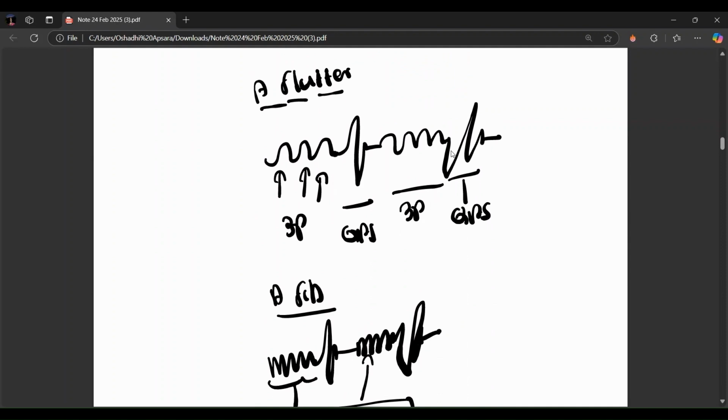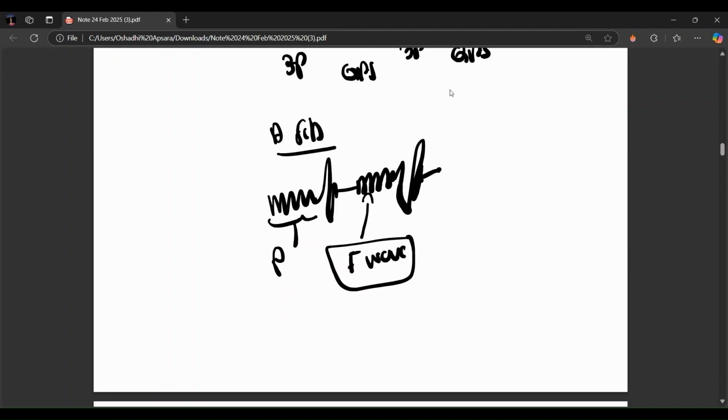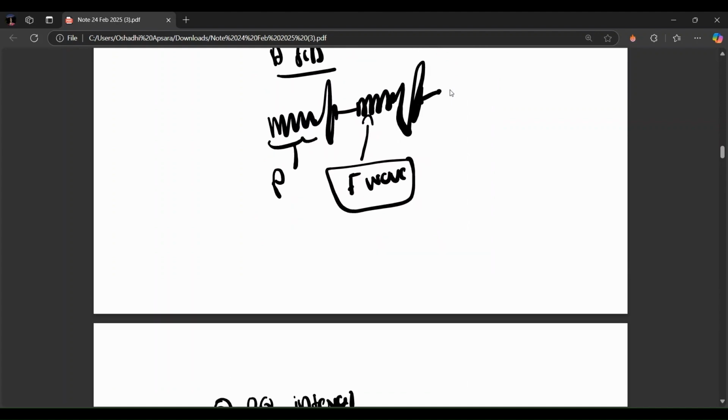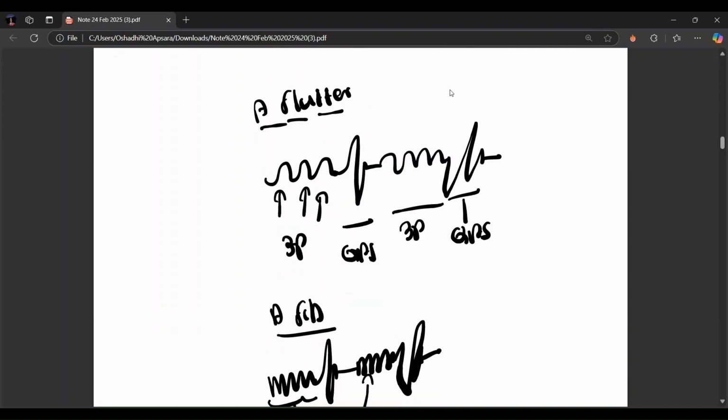It is the atrial contraction. Atria getting contracted, it means what? The SA node sends a signal to the AV node, and after that the atrial myocardium is getting contracted. That is what is indicated by the P wave. Simple, no? But in some arrhythmias, like atrial flutter and atrial fibrillation, there are impulses coming from everywhere. So properly, the atria cannot contract.